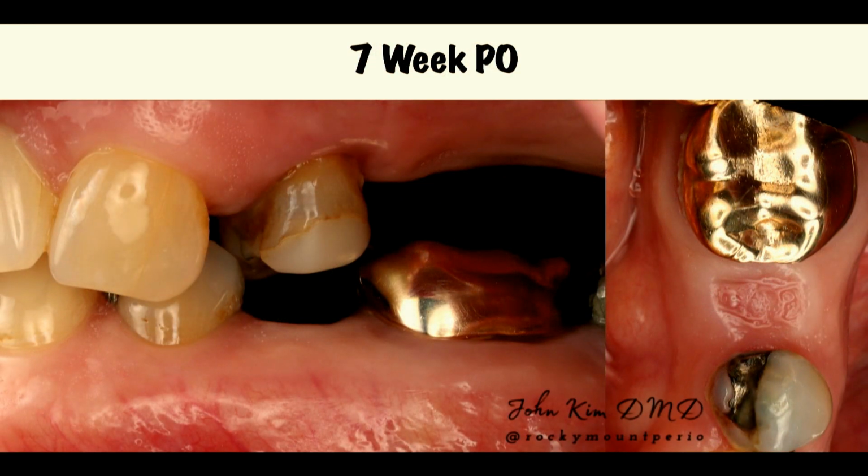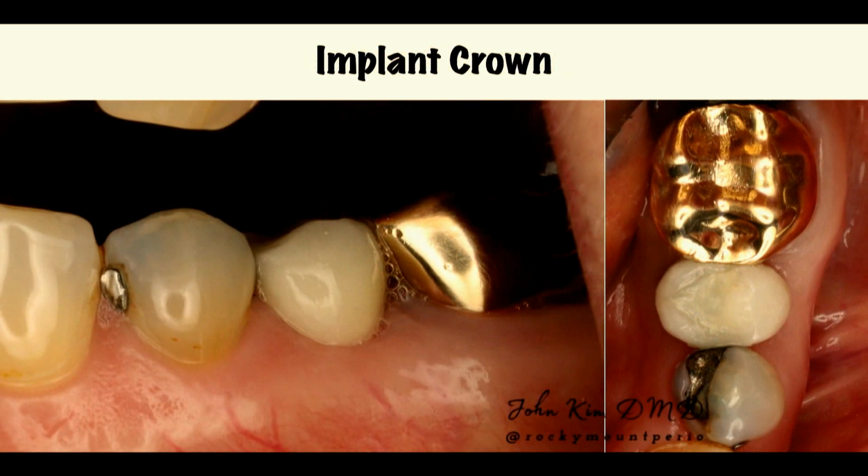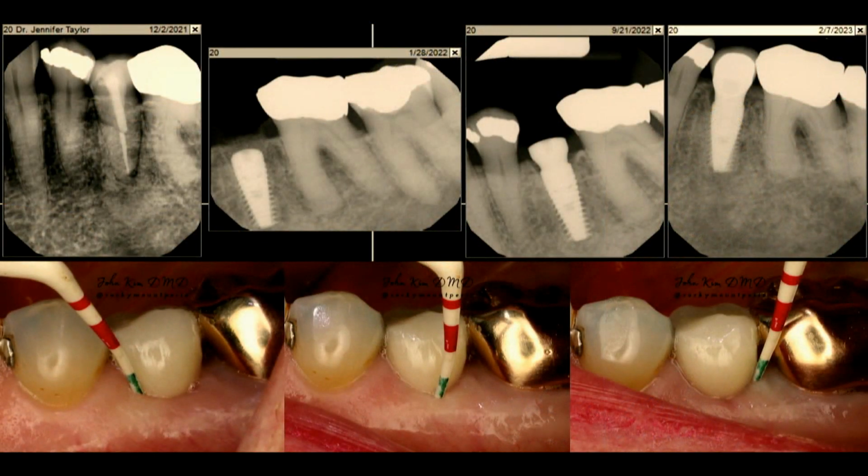Uneventful healing, 7 weeks out, good soft tissue closure, got the healing abutment in place, and implant crown, maintaining good soft tissue profile, maintaining the keratinized tissue. And here we are. I can't remember how far out this is, but probing depth's great. Bone level looks good. Again, very routine, easy procedure to do.